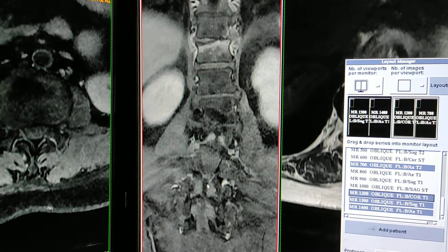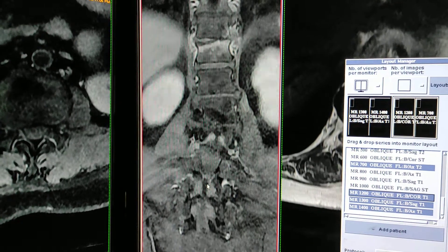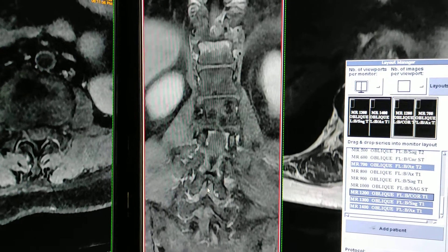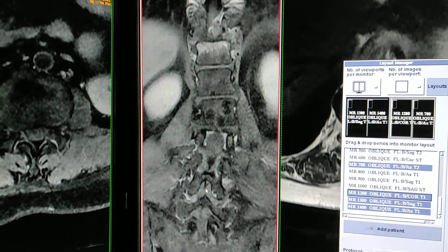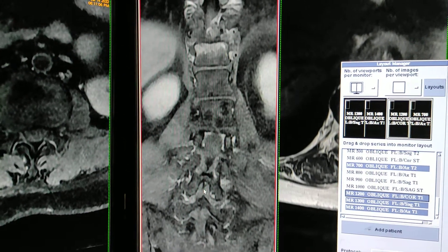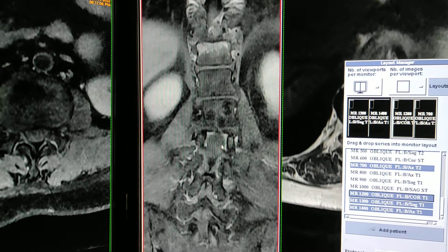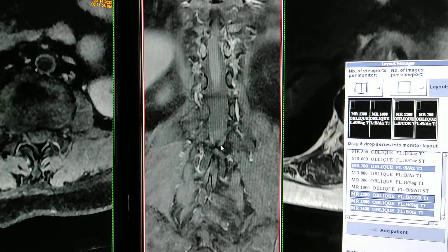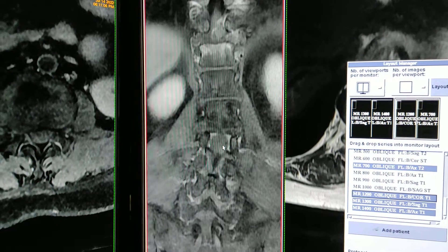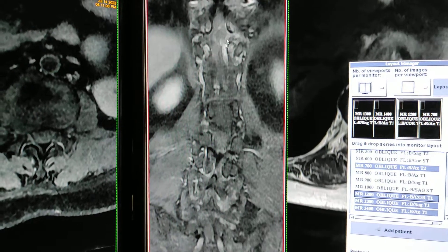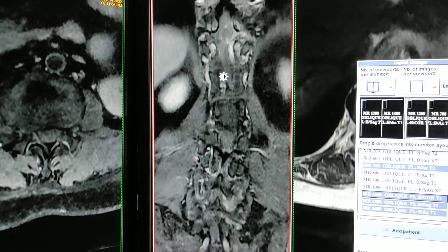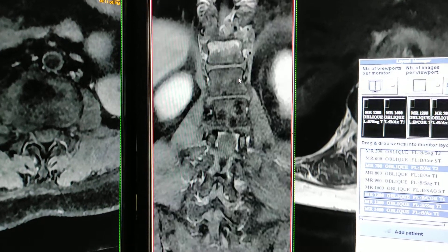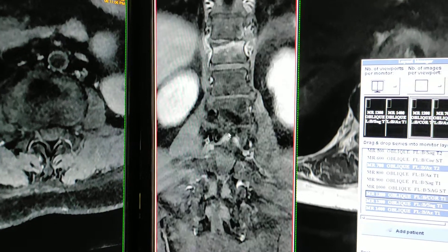There is hypertrophy of the ligamentum flavum seen. This is the lesion. In the bone, the edema is also enhanced — there is bone edema present.